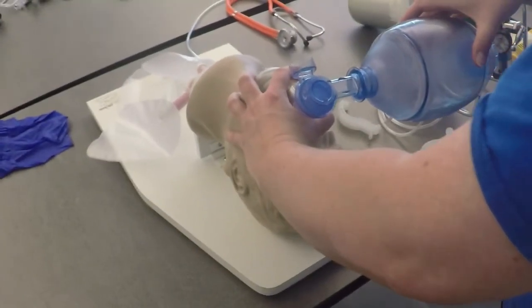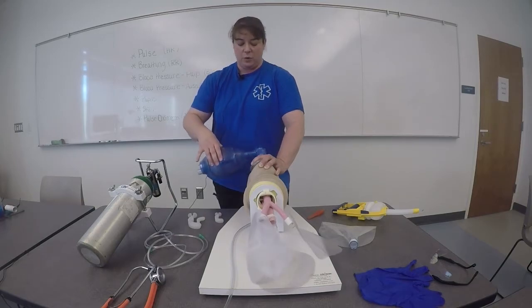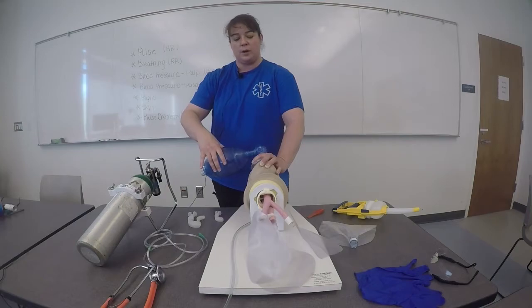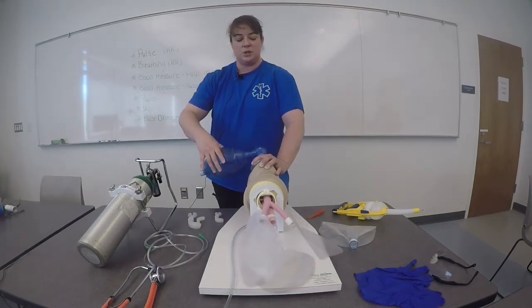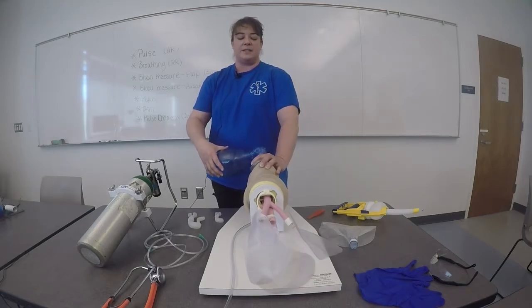[Counting ventilation timing aloud: one breath every five to six seconds, continuing for approximately one minute without supplemental oxygen.]